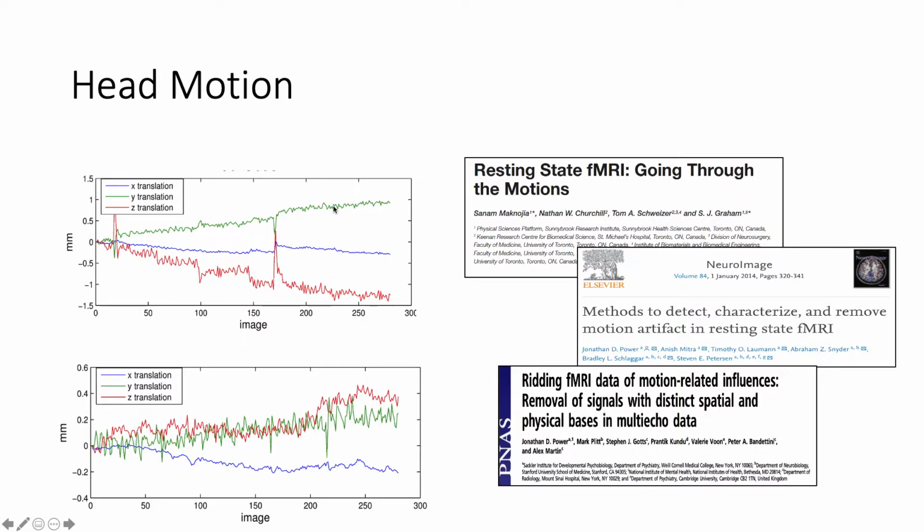That's quite a lot of movement over time, and then sudden movement as well. And so this would be a data set that would be challenging to correct for, and you can compare it to something that was a little better. You can see that the scales are quite different, and this one I think is not too bad. It's doable in some populations, and you might be able to adjust for that a little more smoothly.